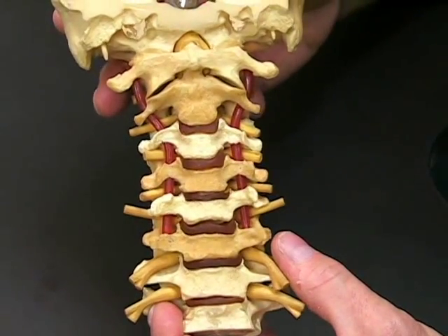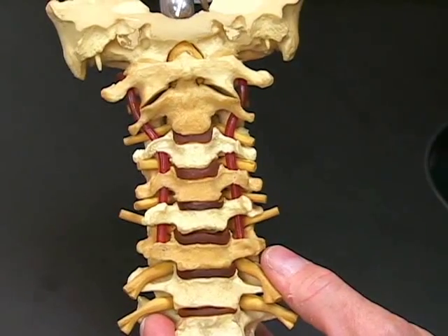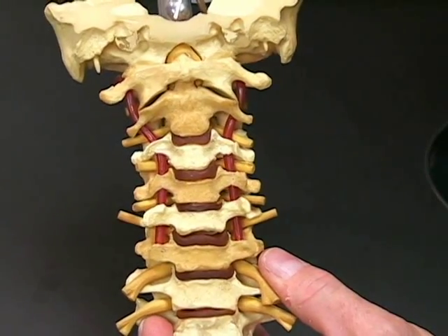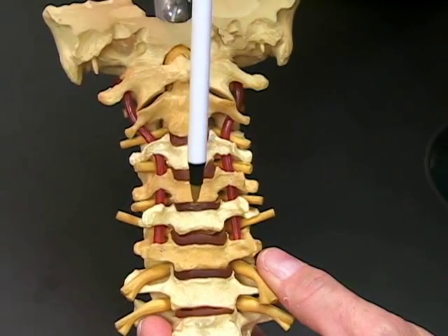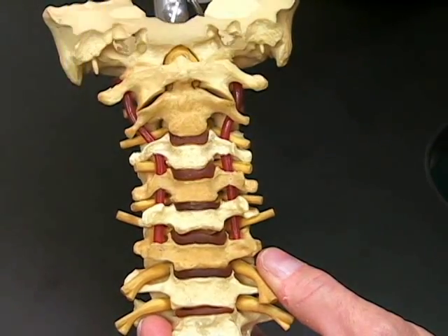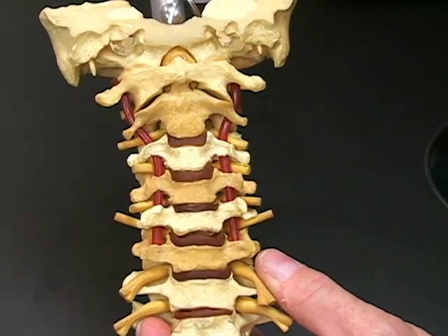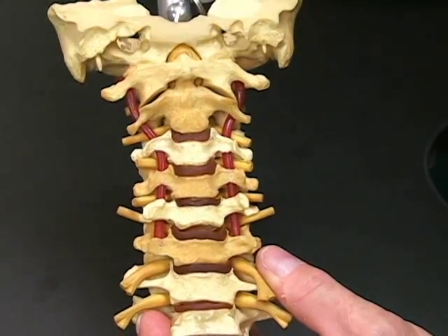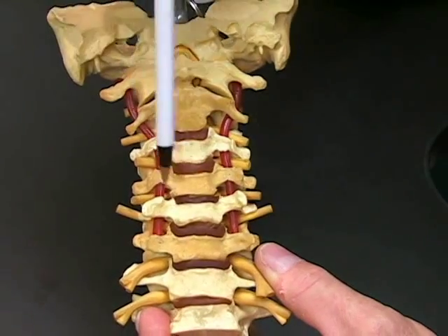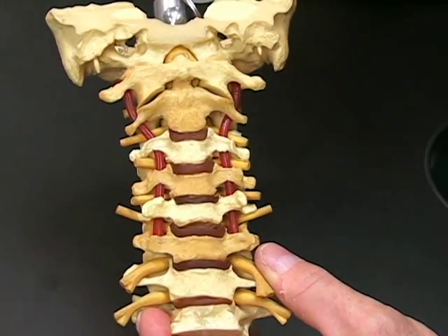When we perform a cervical spine operation, we make an incision in the center part of the neck and generally off towards the right. So most common would be down in this location. We make our incision from the center to the right, over the area where the disc herniation or bone spur or problem exists. After putting a retractor in, we're looking at a small area that may only encompass this large of an area with the retractor in place.